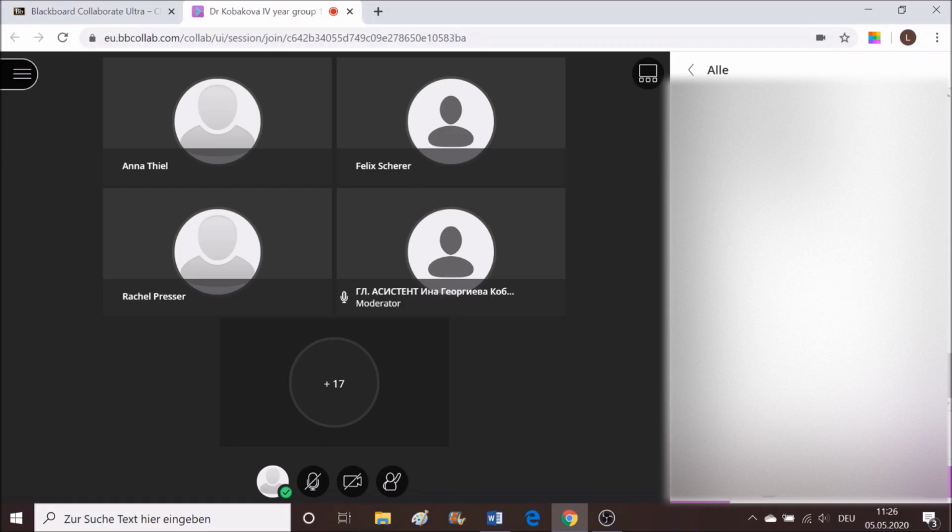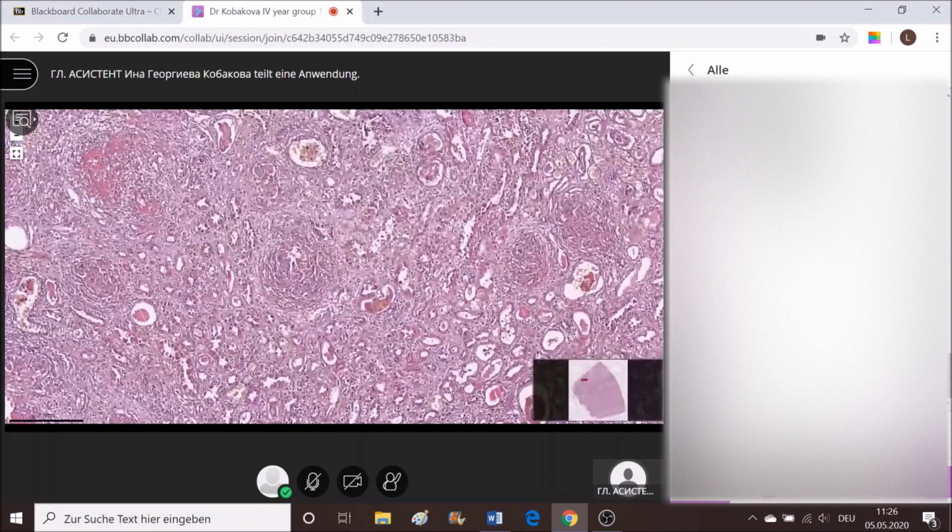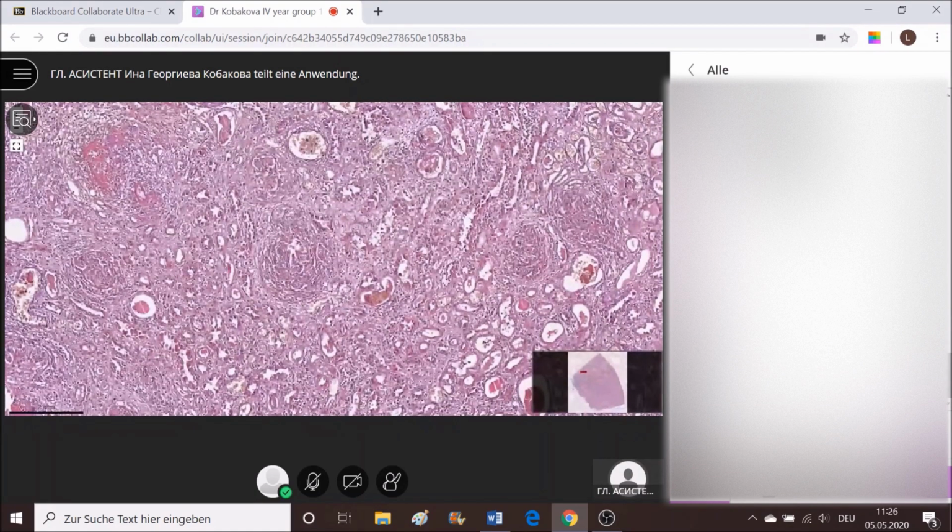Oh, sorry, it's disappeared again. Sorry. I observe another picture, I explain it, and I don't see that it's going again. Sorry. So take a look at this one now here. You see it well, I think.